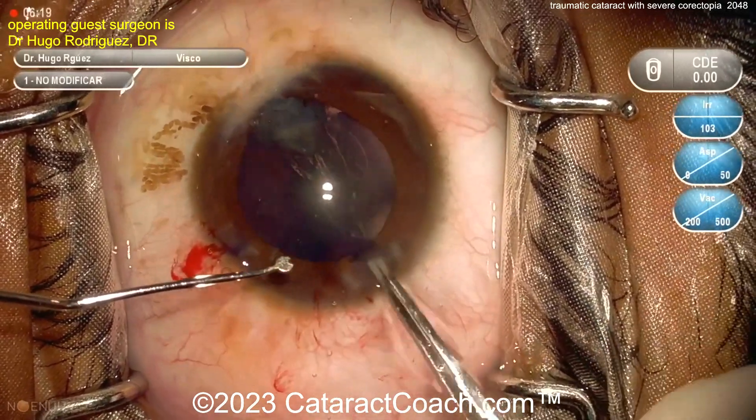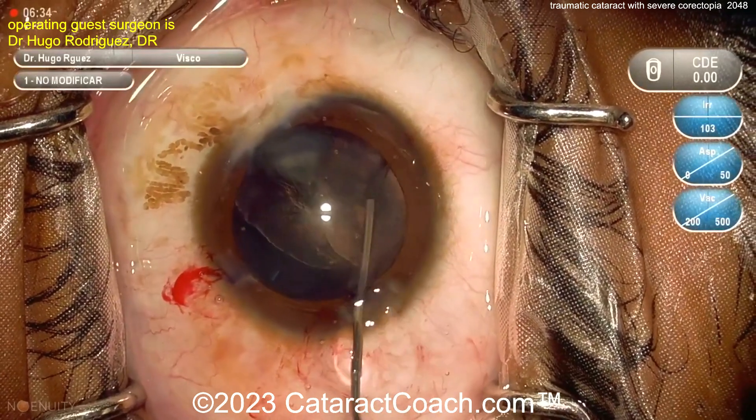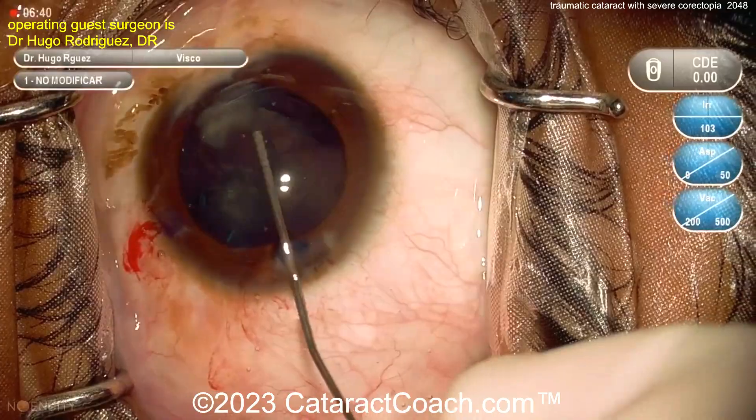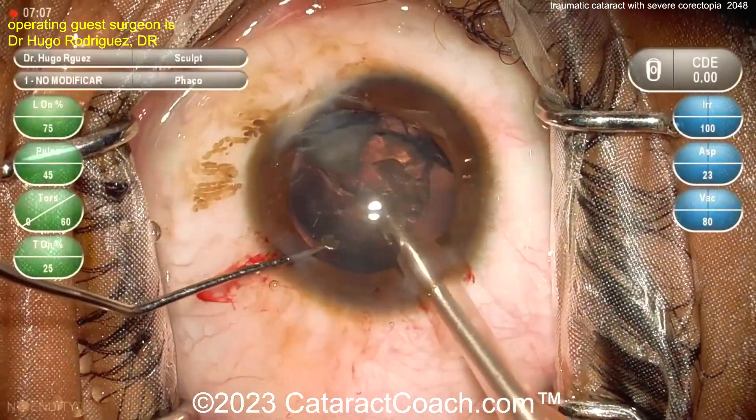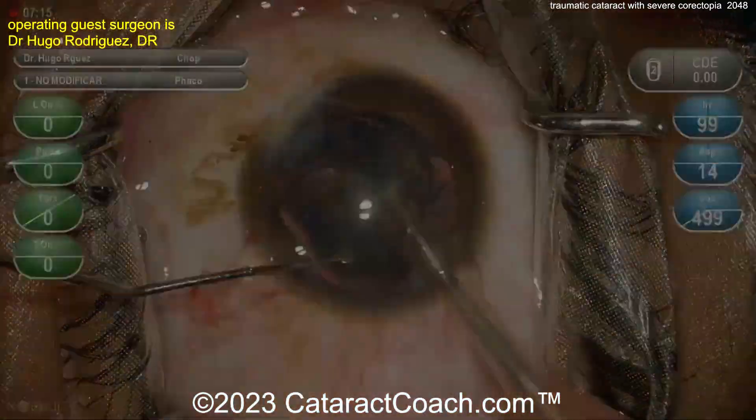Here comes the rhexis. Nucleus removal is going to be easy — it's just this quadrant-shaped cortical wedge that can be removed. Now doing some hydrodissection. The nucleus itself is pretty soft and should aspirate out very easily; no chopping or divide-and-conquer needed here.